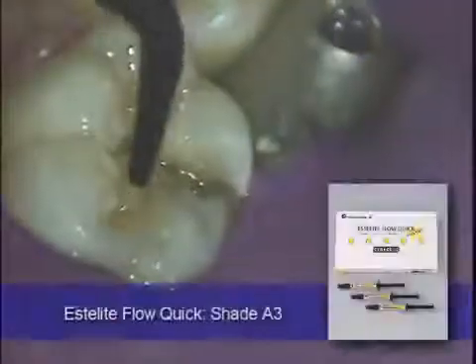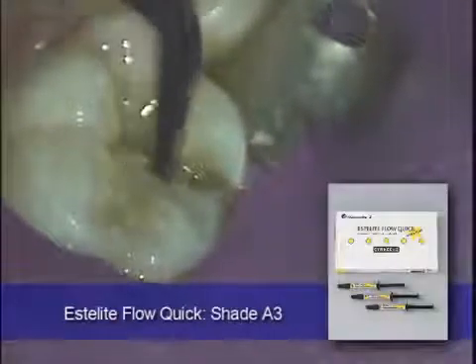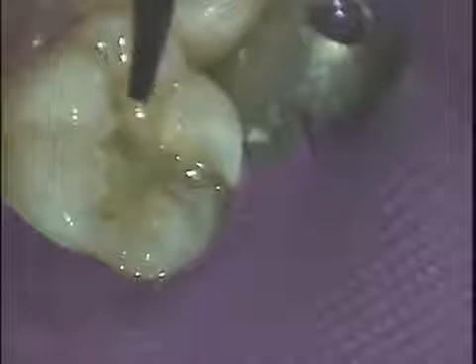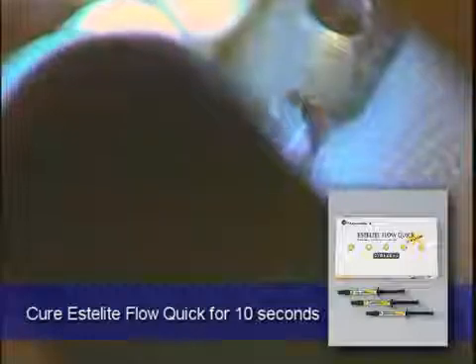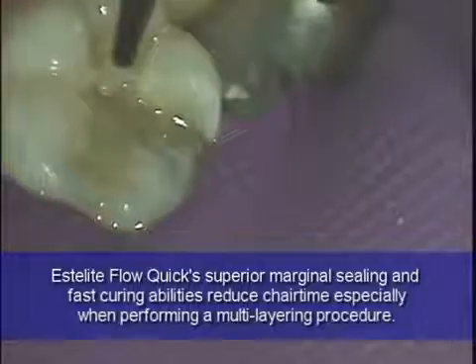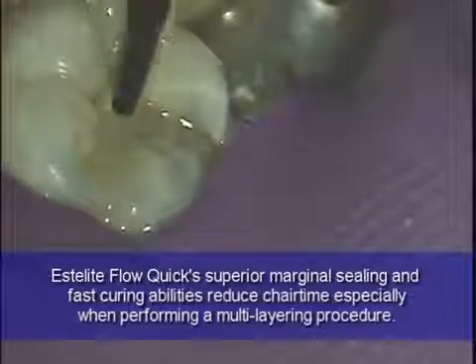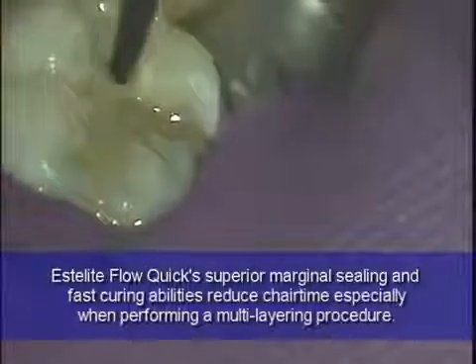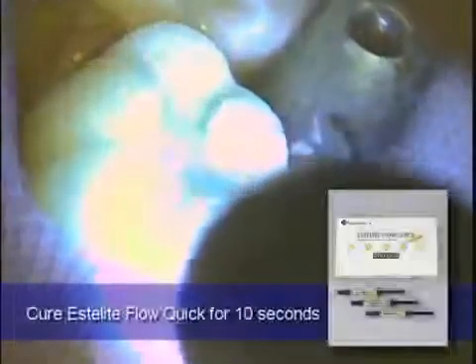The Estelite Flow Quick is then placed in the floor of the cavity preparation as a liner for the initial placement and cured for 10 seconds using this LED light. A second layer of Estelite Flow Quick is applied to the cavity preparation, and then again light cured for a total of 10 seconds.